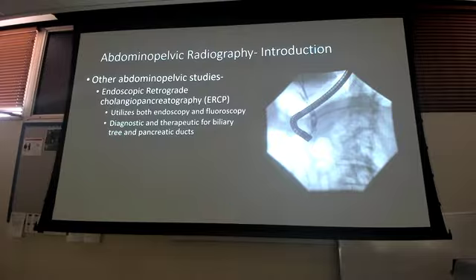So ERCPs are pretty cool. They're diagnostic and therapeutic because when they go in to evaluate, they'll squirt contrast in there and take some pictures. Sometimes the contrast they squirt in will pop a stone out, or if part of the biliary tree is kind of adhesed on itself, that pressure can pop it back open. So that's where it's diagnostic and therapeutic.